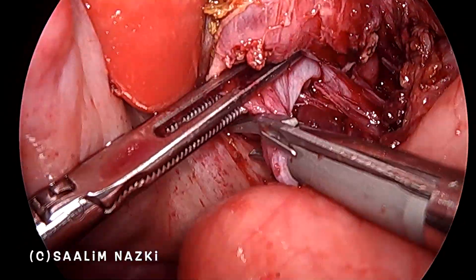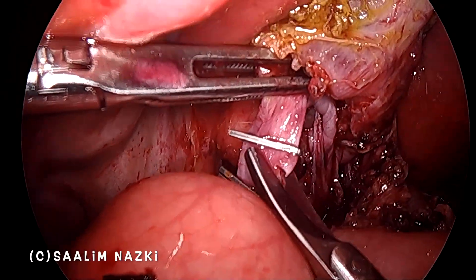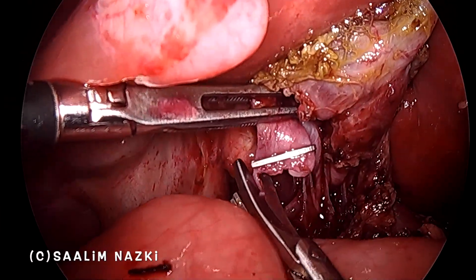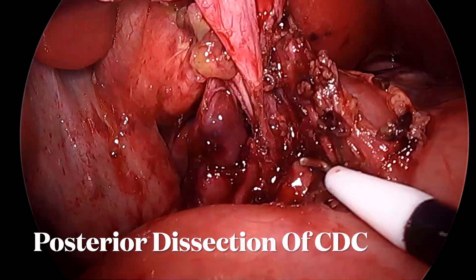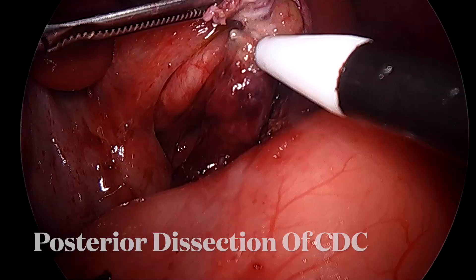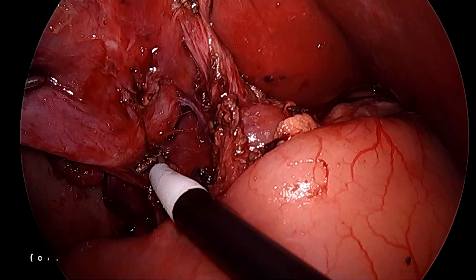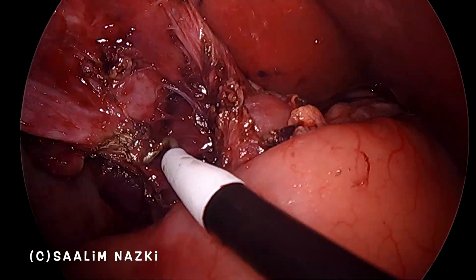Once you have clipped the distal end of the cyst and divided it, we then proceed with the dissection posterior to the cyst, taking very good care that the cyst is not adherent to the portal vein posteriorly, which inadvertently might lead to trauma of the portal vein.